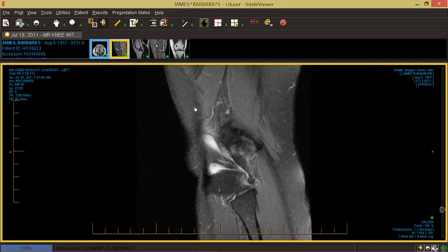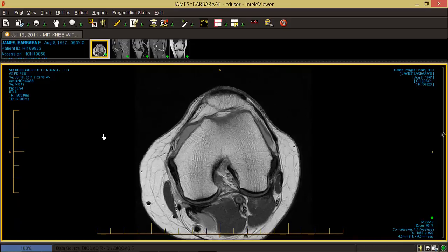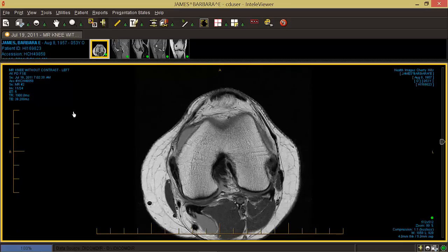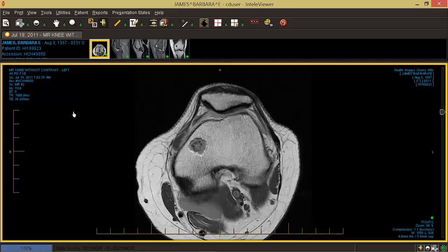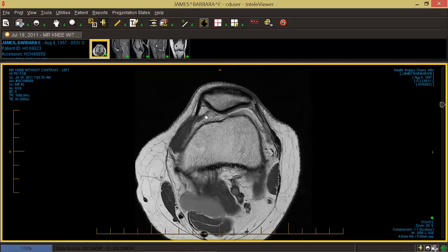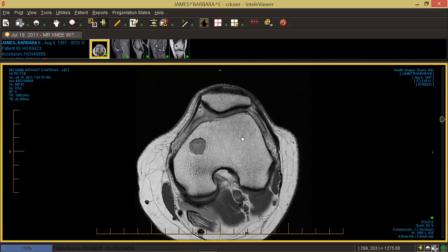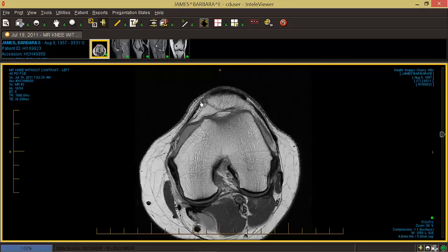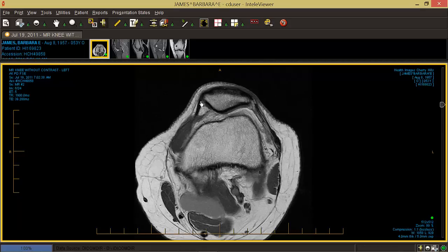We'll finish up with a quick look at the top-down or axial view. One of the first things we notice is the kneecap up top, which sits in a groove. For your purposes, that's really the most important thing about this image. This particular patient has a very shallow groove — yours is probably deeper. Because of that shallow groove, the kneecap doesn't sit firmly and is probably going to move around a lot. You can see the lighter bone and the darker cartilage in this sequence.